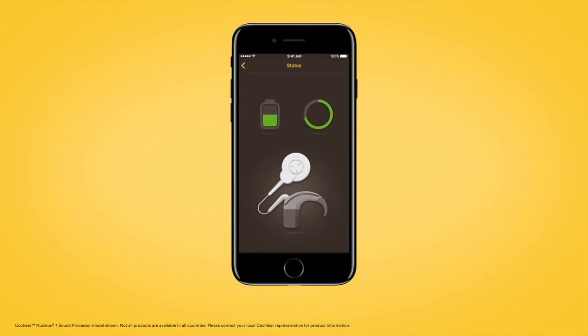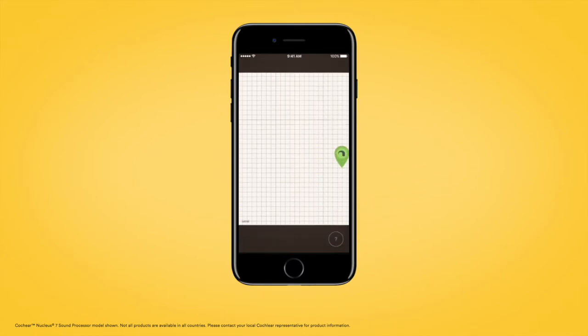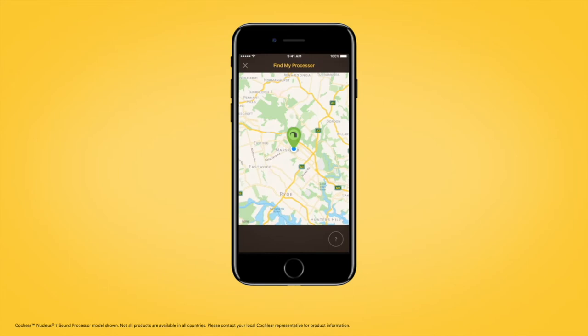You can monitor the status of your equipment and battery life, and for added reassurance, the Find My Processor function can help you to locate a misplaced processor.